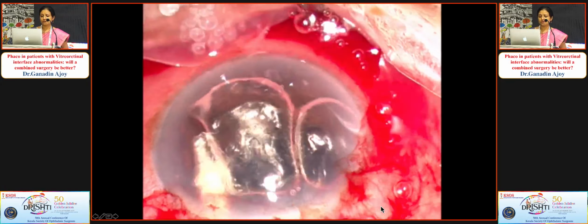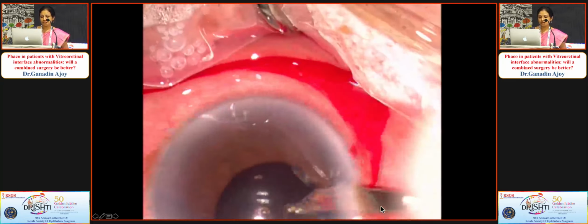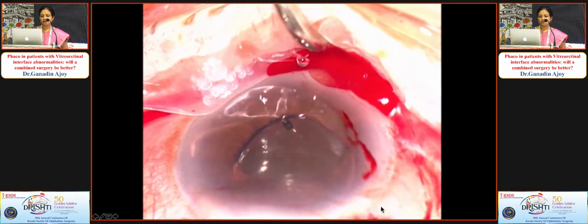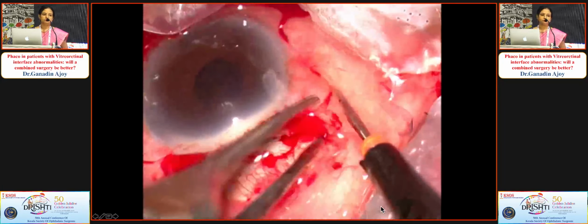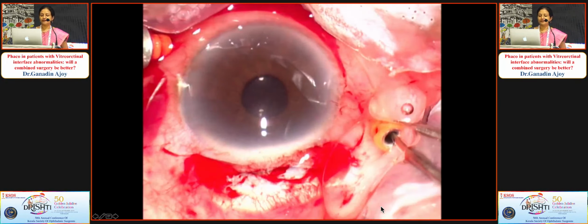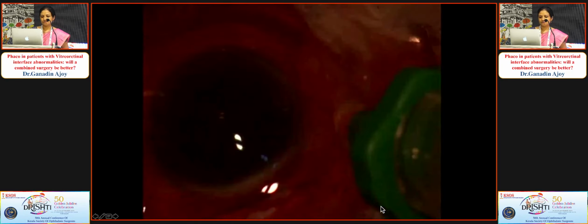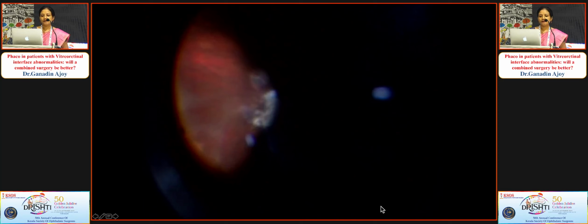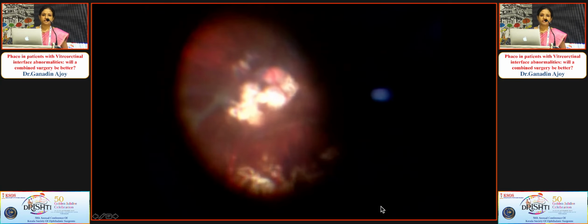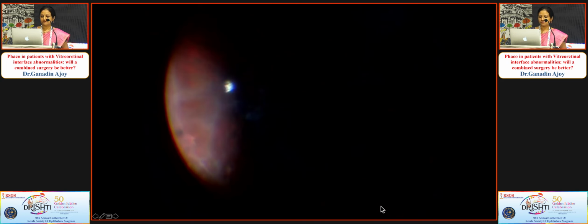So placing the intraocular lens, there is just one more thing that I want to note. The wound is very stable, and after placing the intraocular lens, the pupil size has become even smaller, isn't it? Now, placing the entries, the wound hasn't moved at all. There is no leak from the primary wound, and silicone oil removal has been done. And during this step, we need to do a lot of depression to see the rest of the retina. So this can induce even more post-operative inflammation.